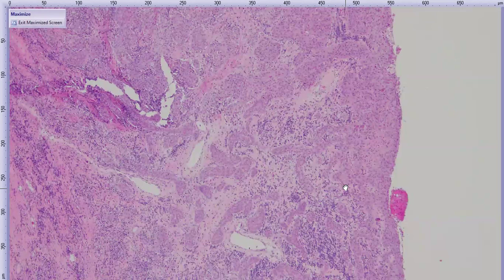So both clinically and grossly, these eyes may often have a differential of mycotic keratitis, and then we find out that it's neoplasia. Some of these cases even arrive with a history of being treated as mycotic keratitis, and they were not responding well to antifungal treatment, as you might expect.